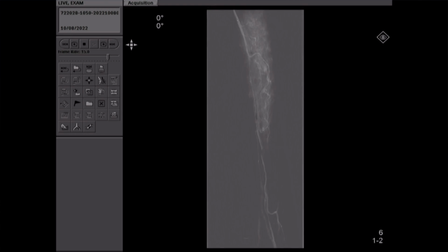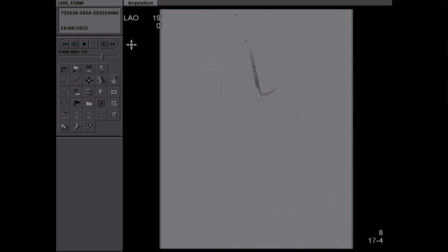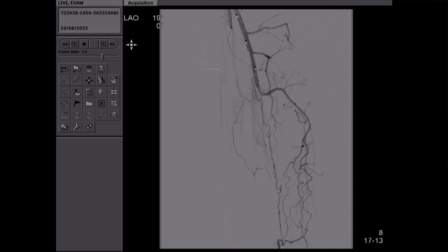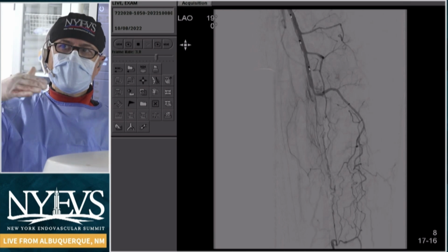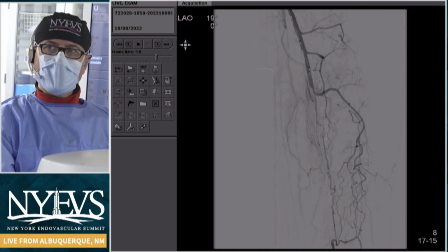I've been hearing your talks this morning, and my usual wire escalation is to start with a 014 Mongo wire, and I shape it and try to steer into that, doing so with a road map. I think that really helps, and if you have that technology, by all means use that. As we get down into the segment where I feel we can cross, you can see that it becomes much more hostile, and my wire simply was not behaving at all. I think you guys talked about CTOP earlier this morning, so you can see the way that everything falls to the side, and so it kept shoving me, as we predict with CTOP, into a subintimal plane.